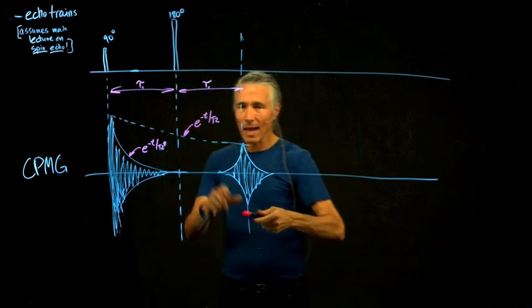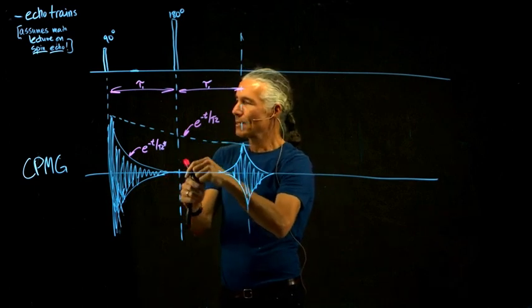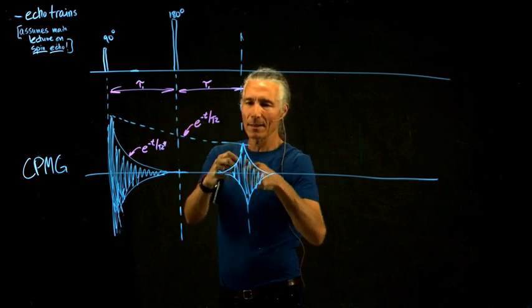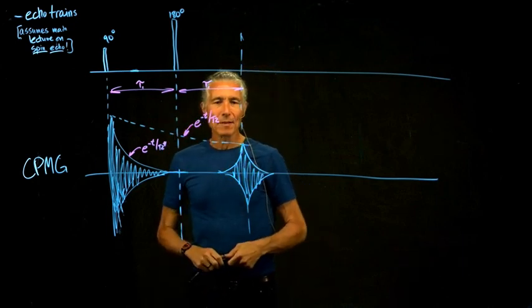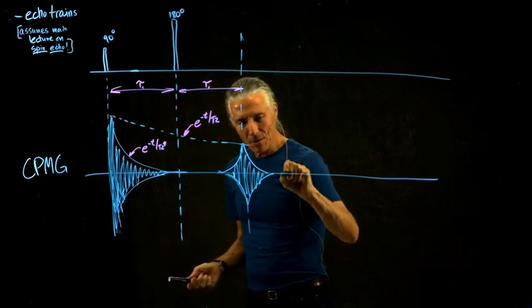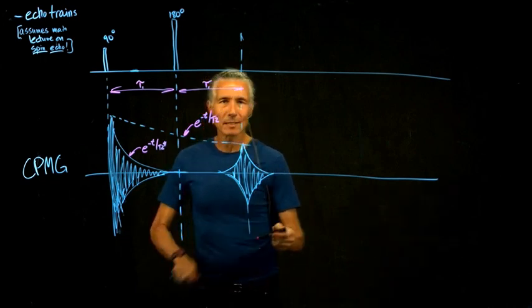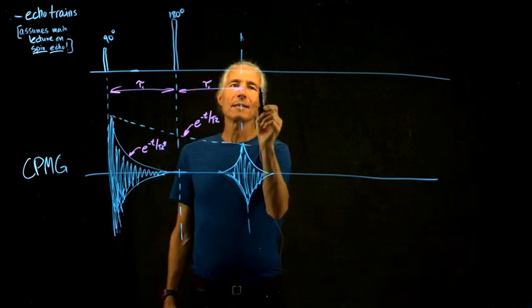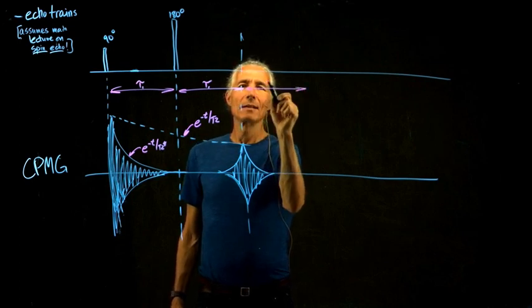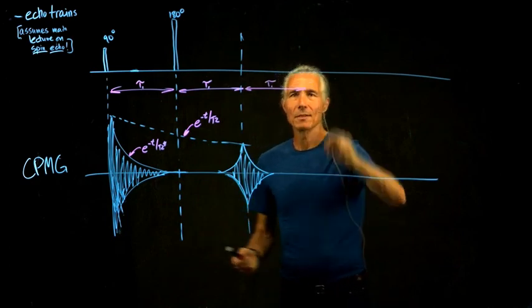So there's a lot of hidden magnetization here that you couldn't see because it was all dephased, and when we did the spin echo, it caused it to come back. But now we've still got a bunch of magnetization left. Even though there's no signal here, there's magnetization left. And so what you can do is basically wait tau 1 again, and then do another RF pulse.